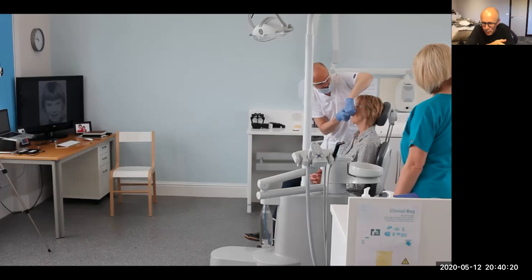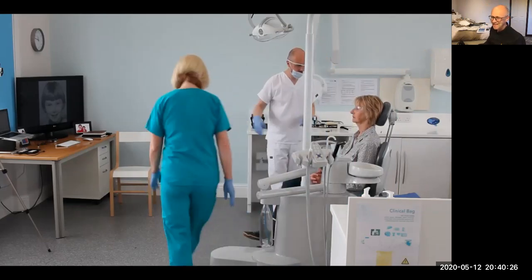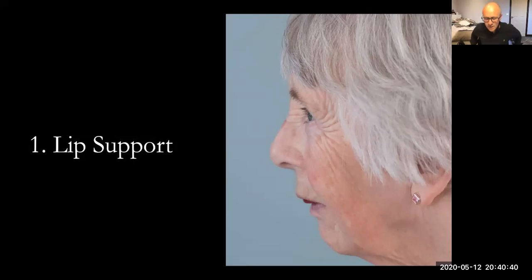But this is what's really important about this stage. I can't emphasize how important it is that the patient is sitting up in the chair, upright. If the head's back like this, I can't see them in a social position. I can't properly visualize it. So that's really important. And the set order to this is I trim the lip support first, get that right.